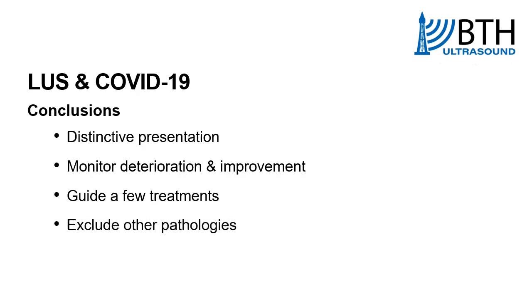It can be quite useful because we may not just be dealing with COVID-19, there's no reason why other pathologies might start to develop, particularly in a critical care population. And most importantly, giving you as a clinician the confidence to make some decisions about instigating a treatment, potentially leaving the management plan as it is, or removing treatments that may not be beneficial anymore because they have hopefully been effective.